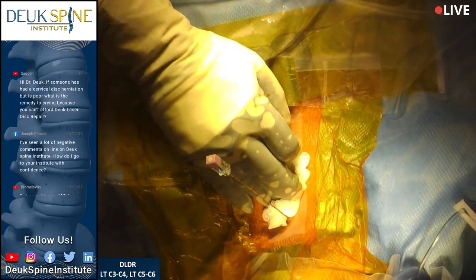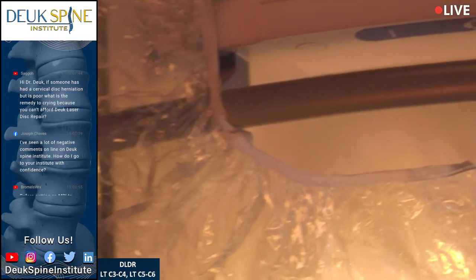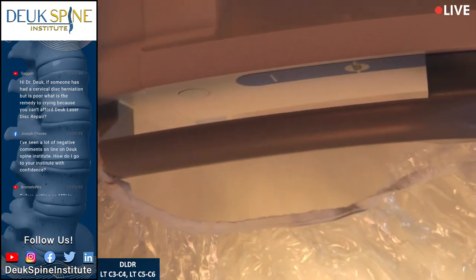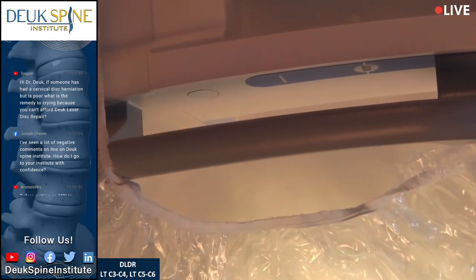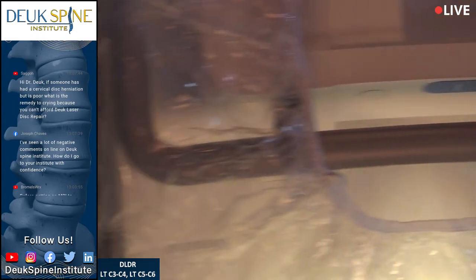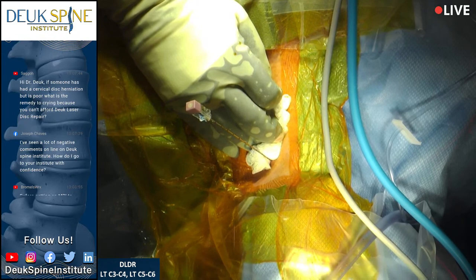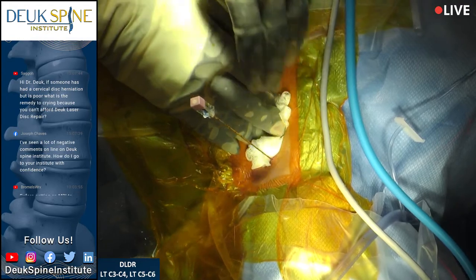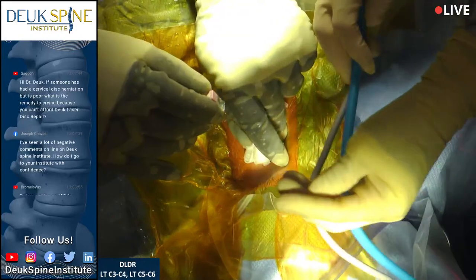Let's bring the fluoroscope in — the x-ray machine. It helps me navigate to the tear in the back of the disc where the herniation comes through, and allows me to localize the right disc to fix. The determination of which discs are herniated and causing symptoms is based on a combination of physical exam and MRI scan. Once I've identified the proper disc, we go in and fix it with the laser surgery.